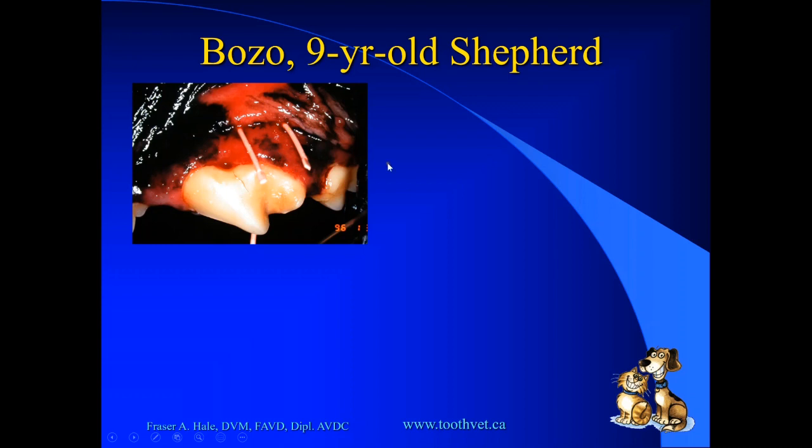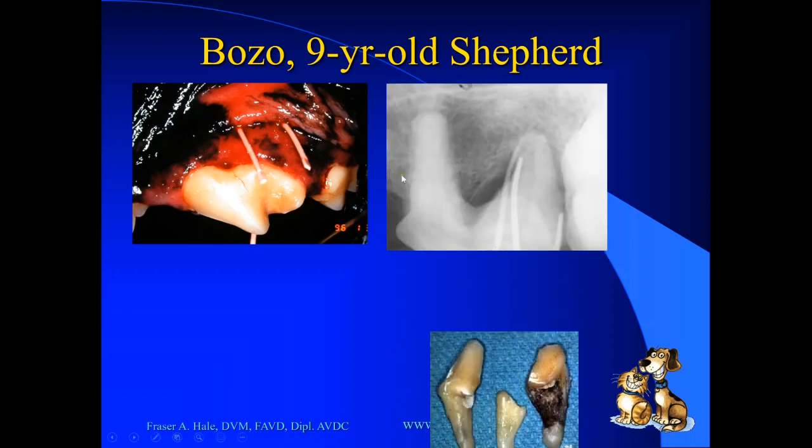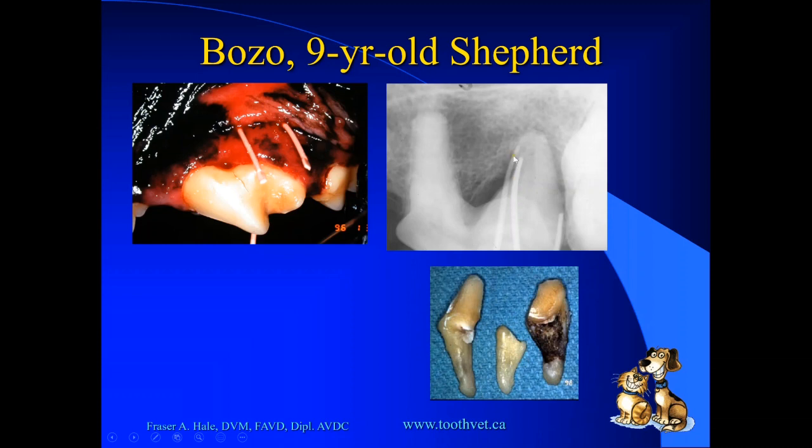And here we get our radiograph of the area, and it shows those probes going into the pocket well below the gum line, deep, deep up the root, almost to the root tip, and quite a lot of bone loss in the space between the roots in the furcation. And so this tooth that looked fairly good above the surface and that the primary care veterinarian thought had cleaned up well had end-stage periodontal disease, clearly visible and demonstrated with this radiograph. You can see when we got the tooth out, quite a lot of mineral deposits on the root structure, but also it's being eroded and pitted by the chronic inflammation below the surface.